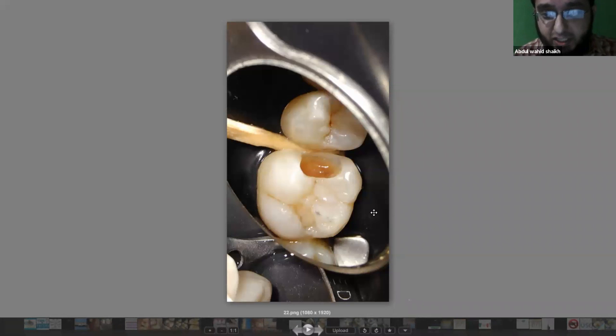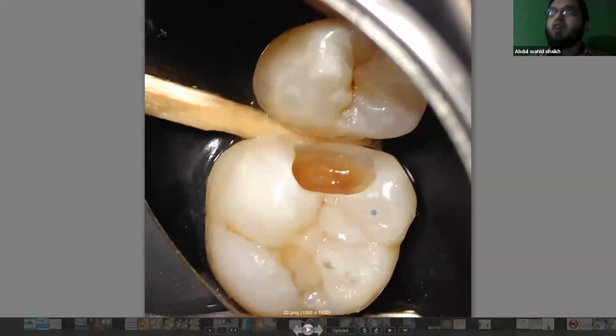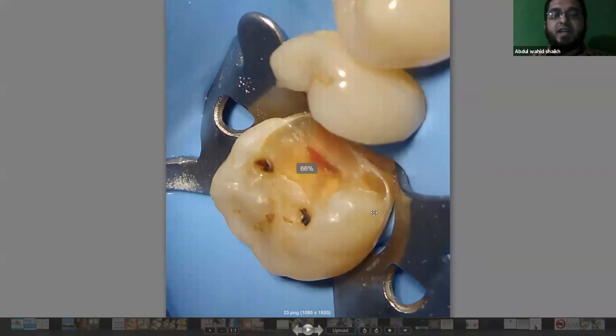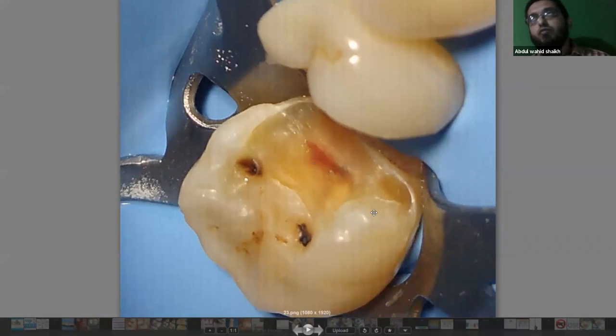Etching time is typically anywhere between 15 to 60 or 90 seconds. A young tooth will have less secondary dentine formation, so we require less etching time. In the case shown here, the patient was in their 20s, so I etched for about 20 seconds. For a middle-aged patient with transparent and sclerotic dentine — like this tooth scheduled for endodontic treatment — if the patient is in their 40s or 50s, we need to etch a little more compared to a young tooth.